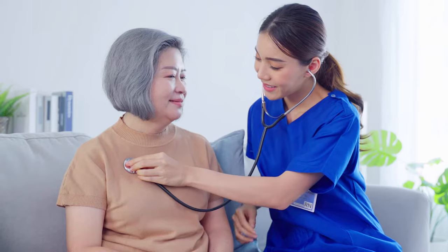You will likely have seen one of these devices before, either placed on your chest or draped around the neck of your favourite healthcare professional. This is of course a stethoscope and it forms an absolutely crucial part of many clinician toolkits. But how exactly does it work, and how do we actually use them? We're not just applying them randomly to different parts of people's bodies — there is method and logic. This kicks off a brand new series of videos exploring the different tools and pieces of kit that doctors use regularly, starting with the humble stethoscope.